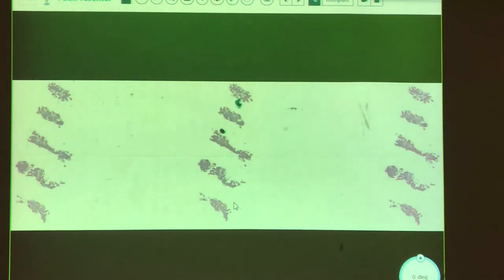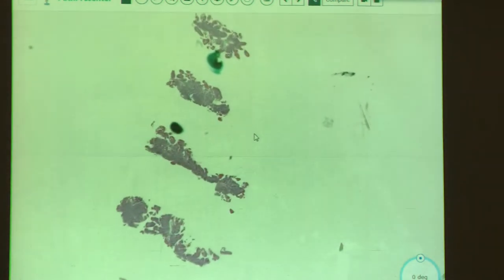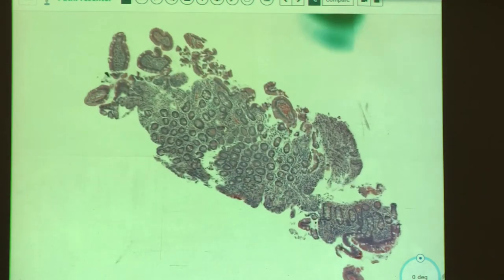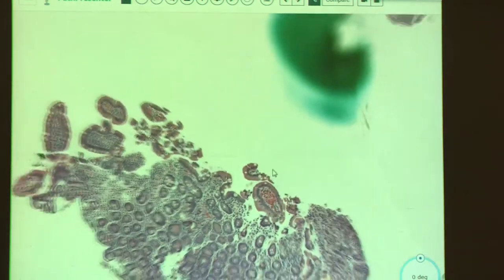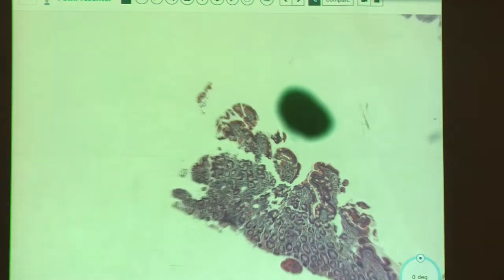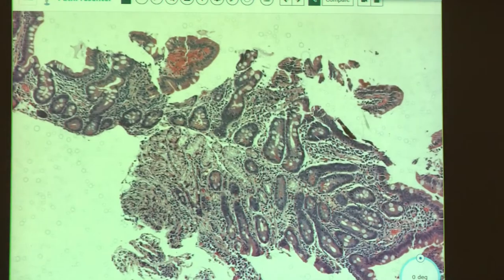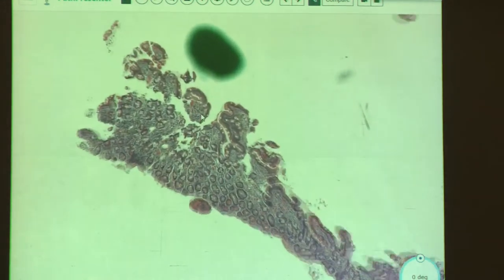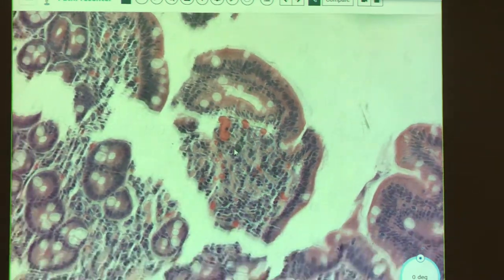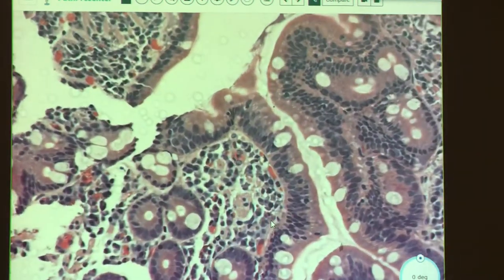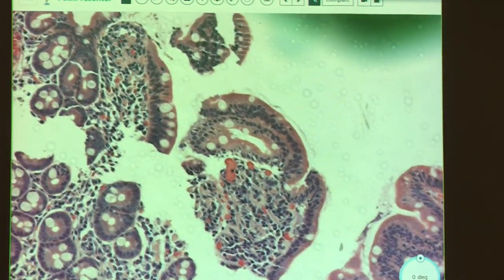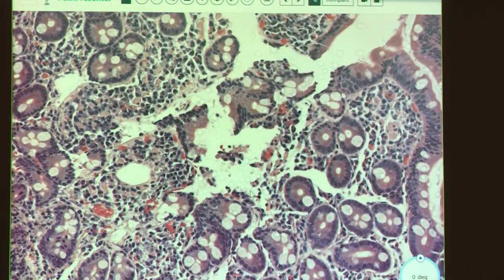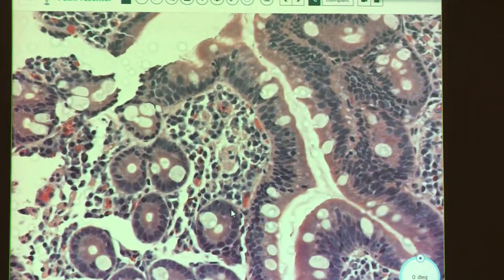Case 4. Very blue, very inflamed small intestine — possibly duodenum based on pale foamy-looking structures. There's something very subtle here. Looking right at the annotated dots, there are tiny organisms — very small, very easy to miss. Something with 'micro' in the name — Microsporidia.